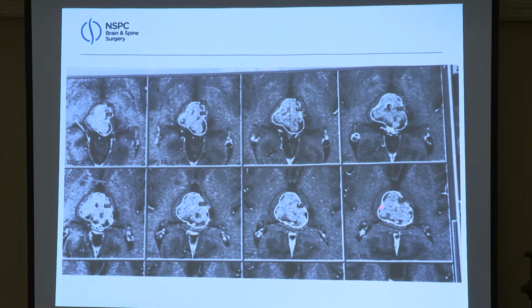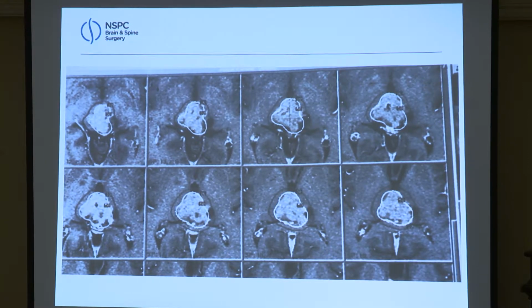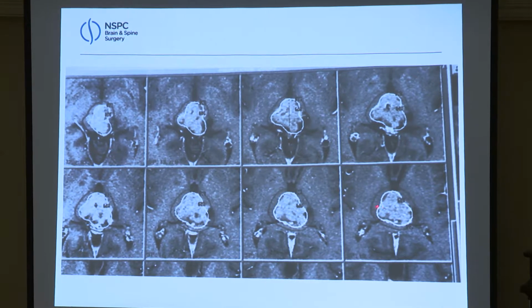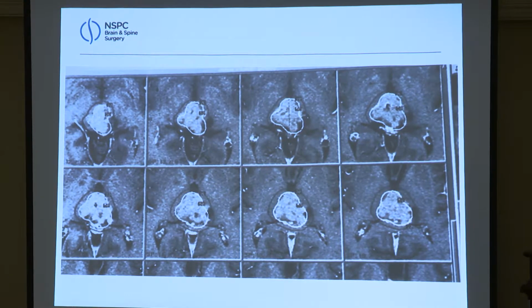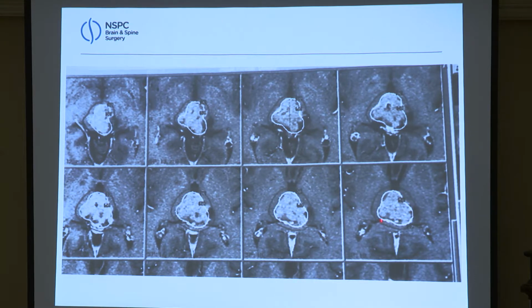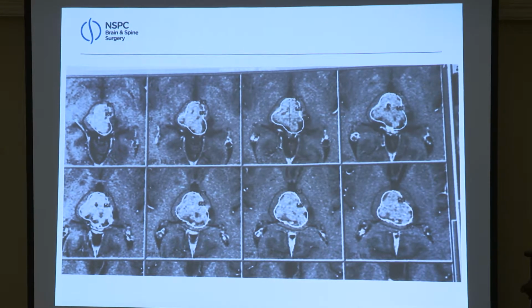And the other thing, which is a little harder to see, is that we're showing some of the isodose lines, that the fall off is very rapid. Once you leave this, and Gamma Knife usually targets the 50% isodose line. Most linear accelerators target the fall off point, which is the targeting isodose line. The isodose line, you want to set it to where it's going to fall off most rapidly. For Linacs it's usually the 80%. But this is the 50% isodose line, and again, you want to see that the radiation falls off very quickly from there.